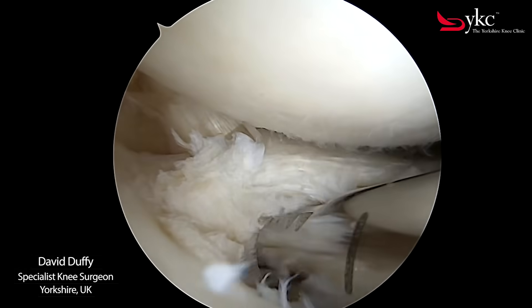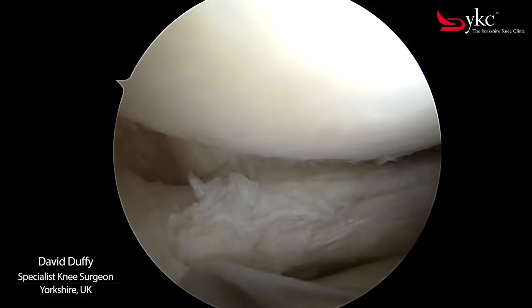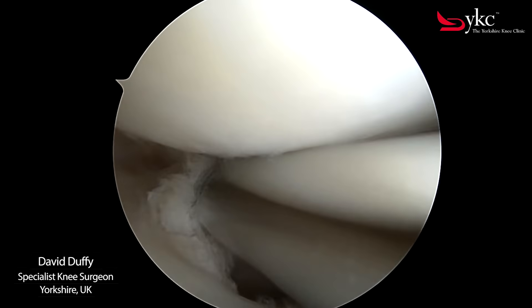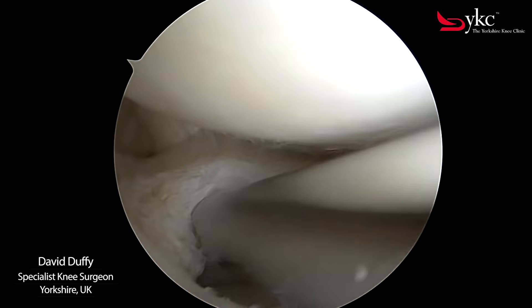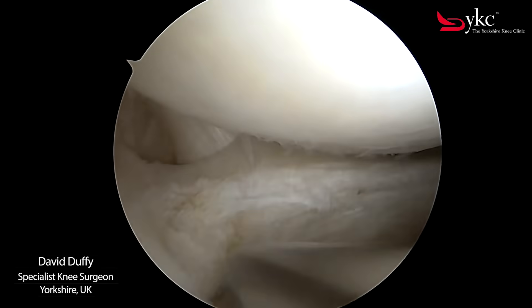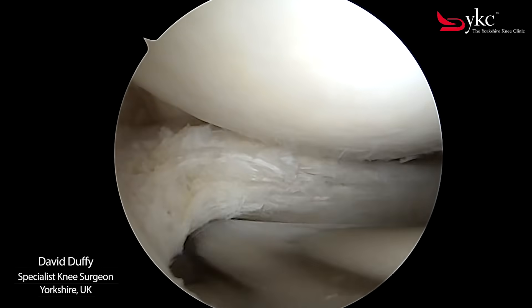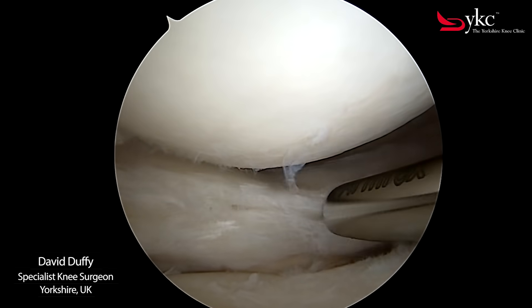In young patients this type of injury occurs due to a forceful action such as a deep squat, pivot or direct blow during sports. In older patients less force is required to tear the meniscus and symptoms may develop more gradually. You can now appreciate how with using the shaver all the loose fragments have been removed with the edge of the meniscus now appearing stable.